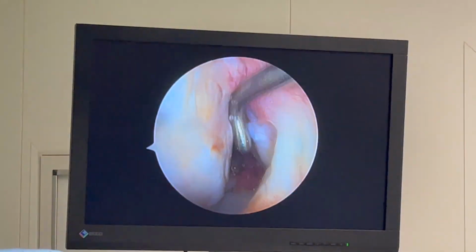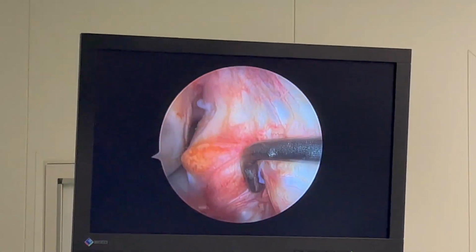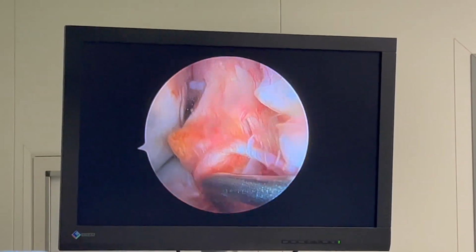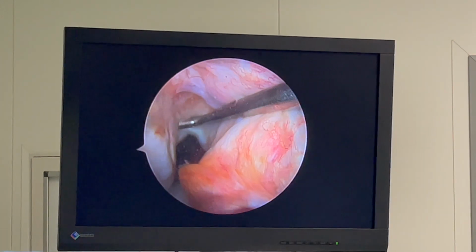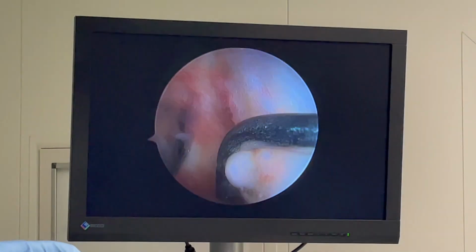So this is the PCL, what we call the other ligament, which is coming from the back, right? So there should be another one starting from here. There are some parts of it. You can see. Yeah. So this part should have been there, here, right? Going across. So that's why it's called cruciate, right? So this is the broken part which we are going to remove, and then we'll put a new one in, right?